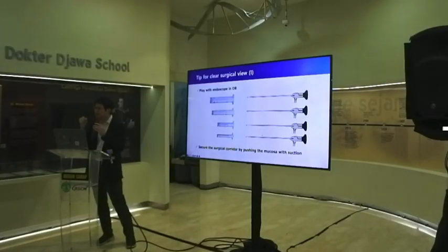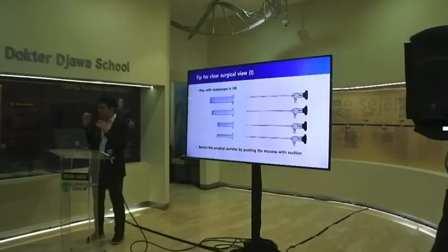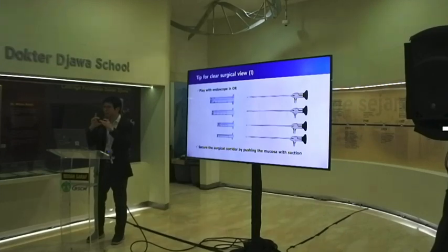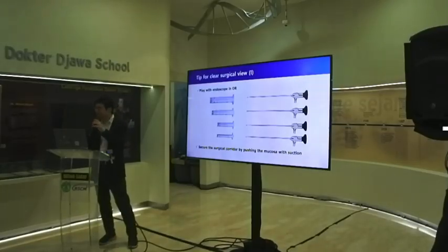When I first started my endoscopy course, I cut syringe tips and practiced inserting the endoscope through the very small syringe. By practicing that, I got used to the endoscopic manipulation, and when putting the endoscope through the syringe tip, there was no vibration, like tremor. So practice makes perfect. At first, you should get some practice. Like this.